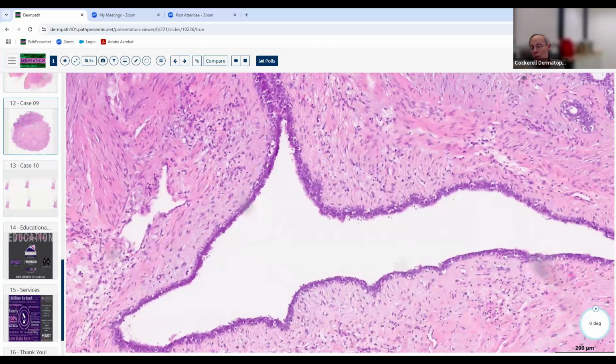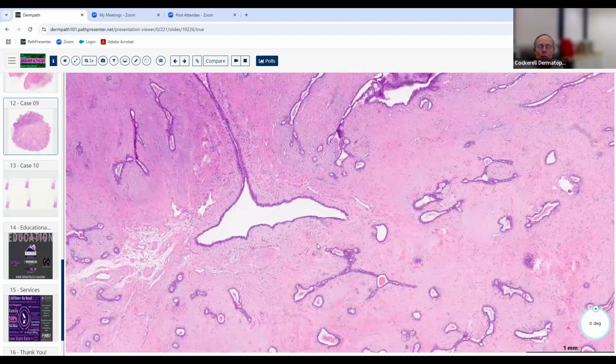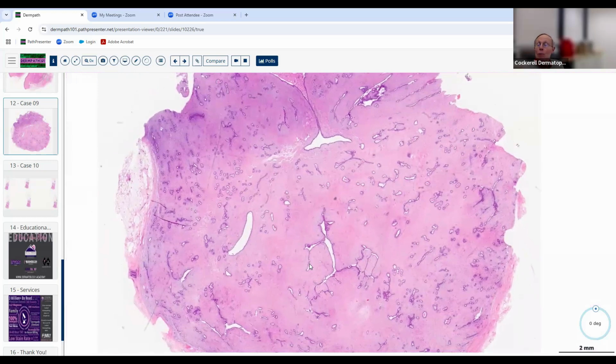This actually came from the breast, interestingly enough. So it came from the breast. We already talked about the breast being an apocrine gland that just got massively large. So it's also apocrine. So here we've got what's known as a fibroadenoma. Fibroadenoma is a lesion on the breast, quite common. Totally benign lesion. This is a classic example of it.